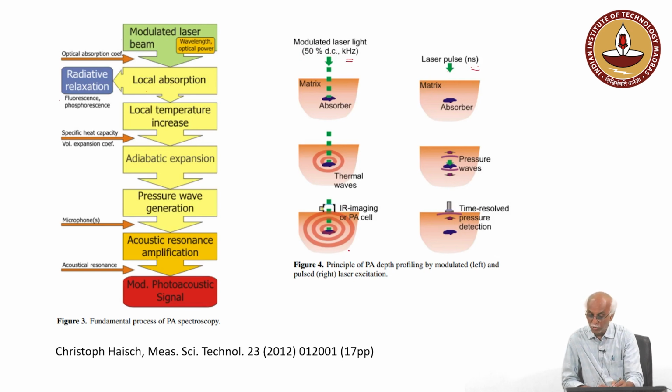We can use it as a modulated source or a nanosecond pulse laser. If we send a single pulse, we can see that acoustic waves are generated due to the pressure change, adiabatic expansion, and the pressure which is increased in this confined region will decay with time, because as the pulse ceases, the pressure pulse will also start decreasing.